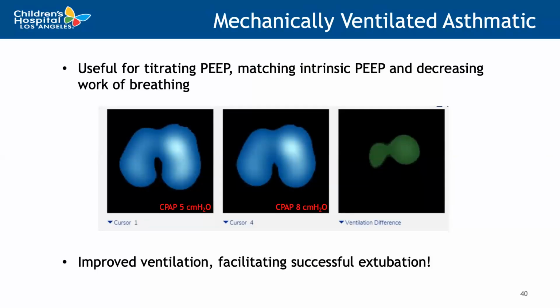So this patient went on to be successfully extubated on a higher CPAP level of 8. And so this was a successful outcome. And I think it really is important in a couple of ways. It shows not only how to manage some of these patients, but it also allows us to see in real time what's happening physiologically at the bedside, and kind of proves a lot of physiologic concepts that were previously understood.